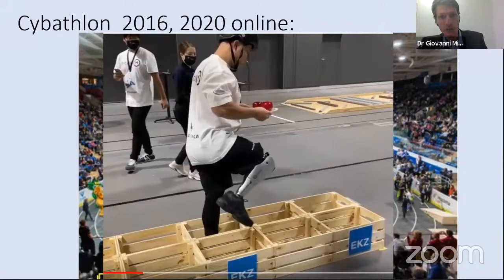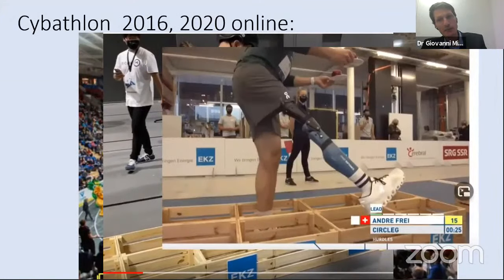This man is wearing a robotic leg, which probably would have cost tens of thousands of euros. So it's a research device, very expensive. And he's performing a very difficult task, carrying apples, walking through boxes. In contrast, here we have a 4-bar linkage leg. You can see the patient is using it very differently, but this has got no electronics and no control system. And it's also a Swiss group, but it's a 4-bar linkage, as many of us know, these polycentric technologies.